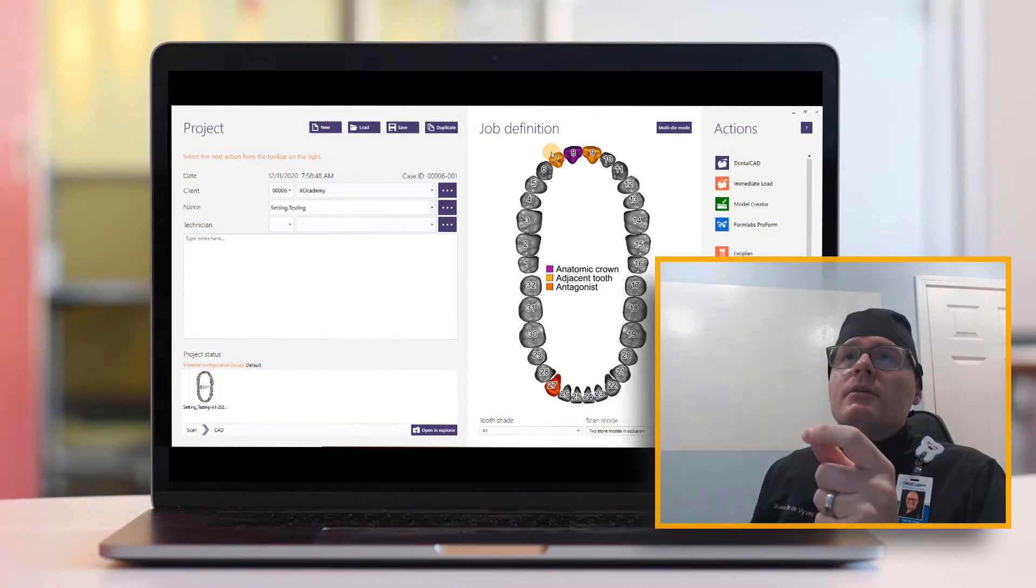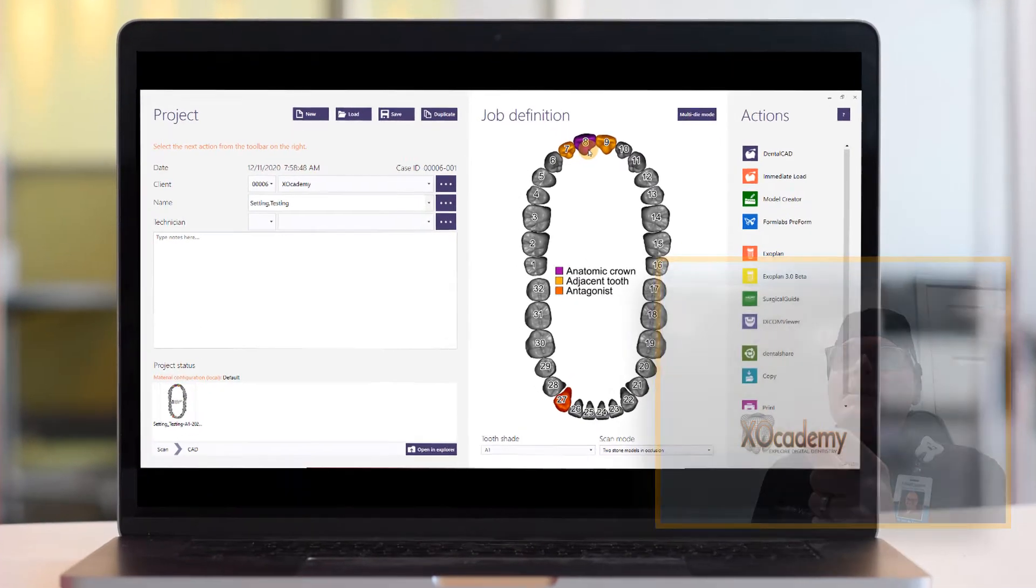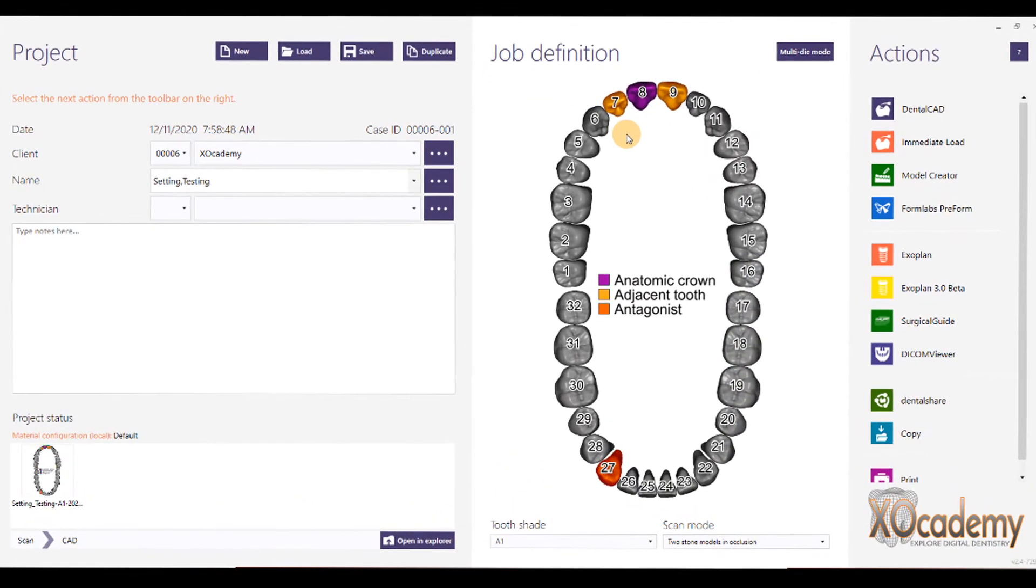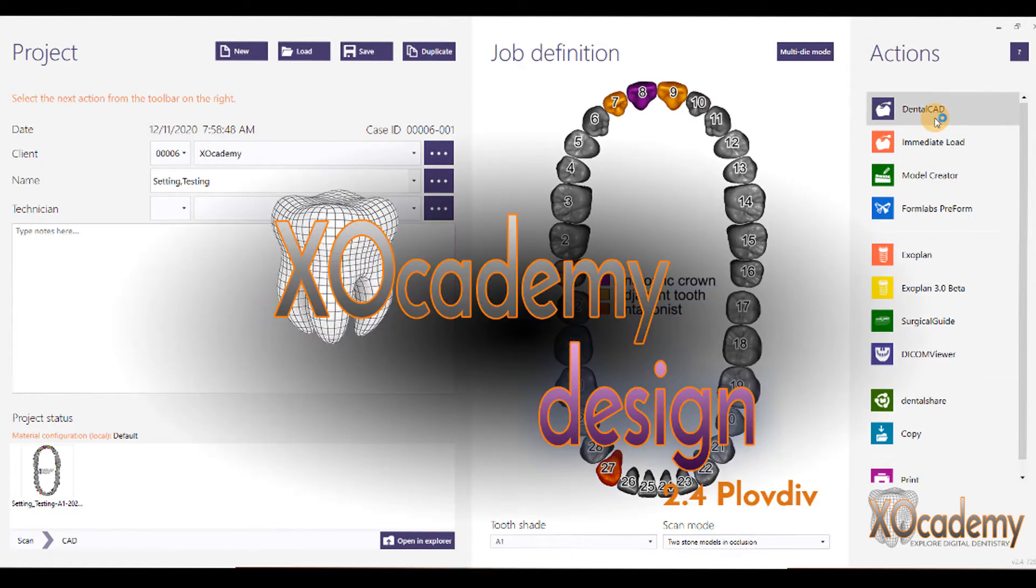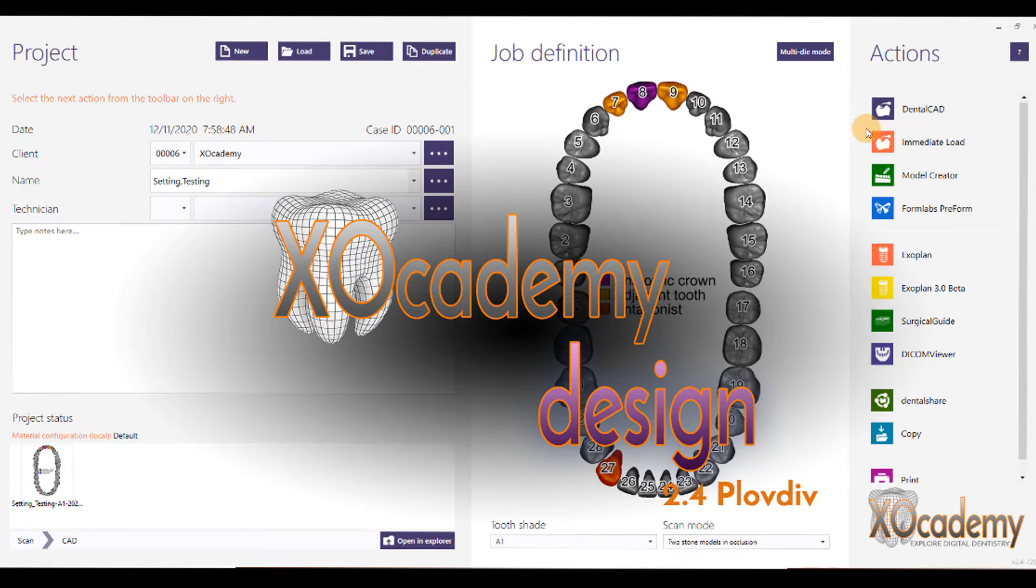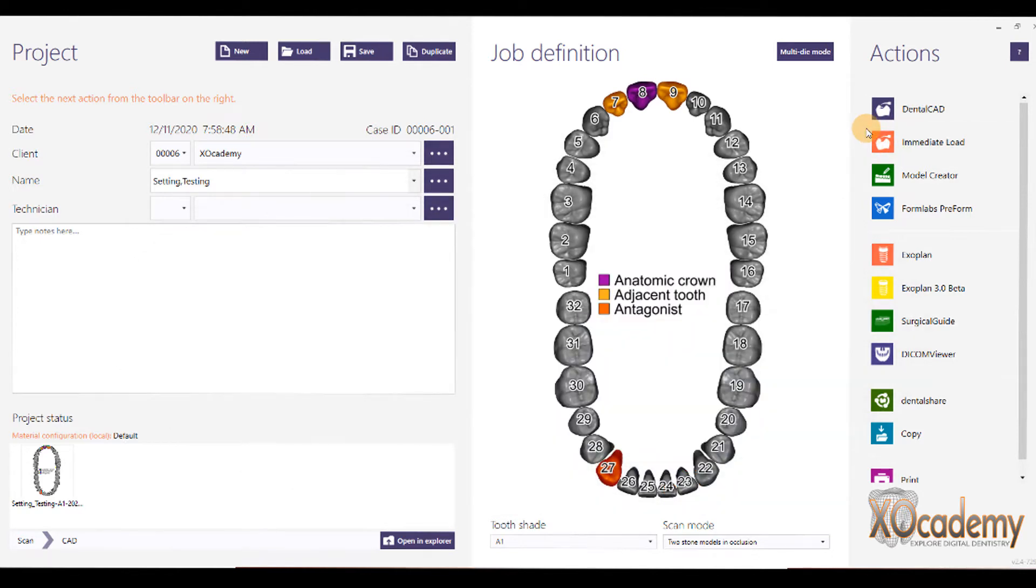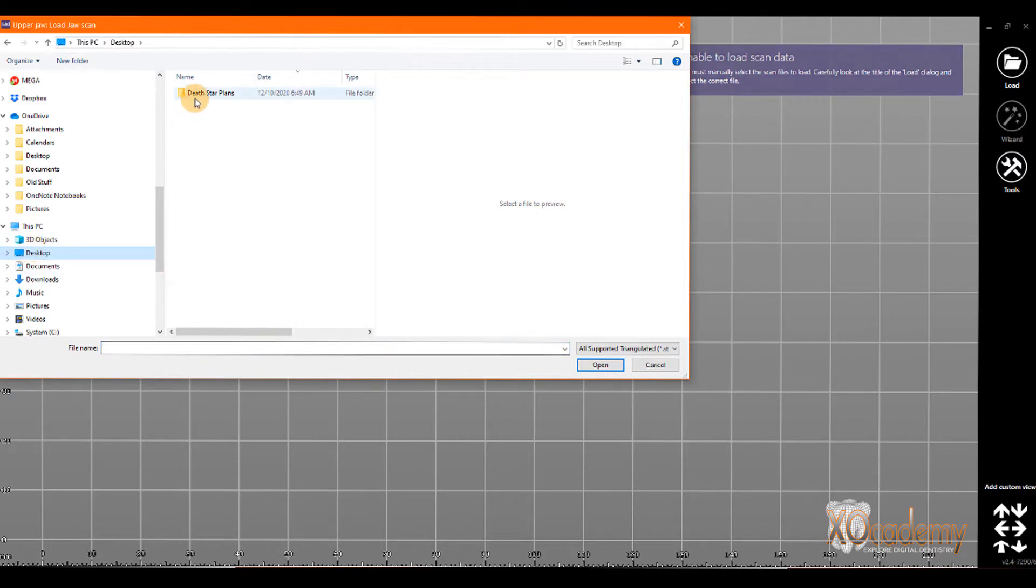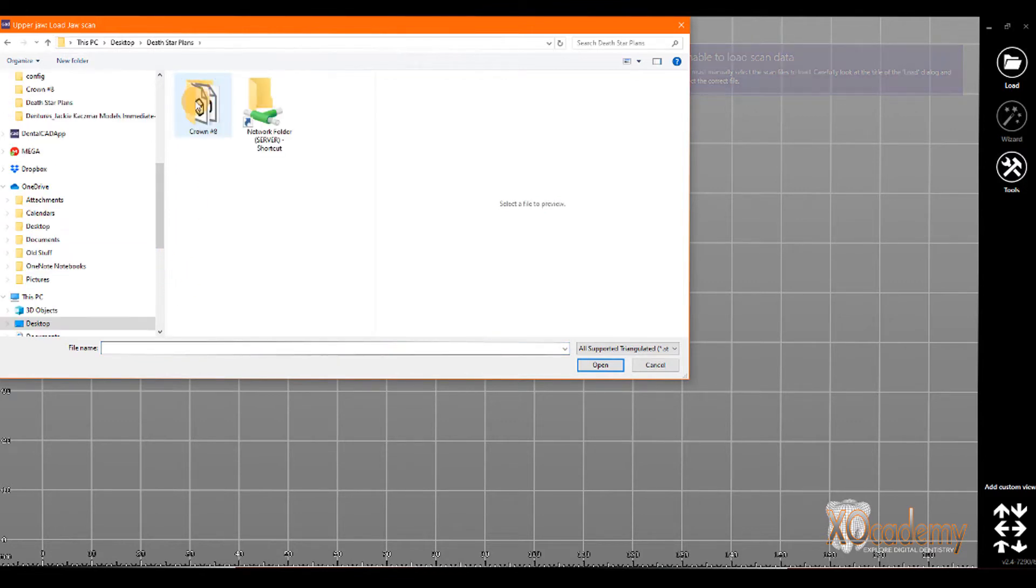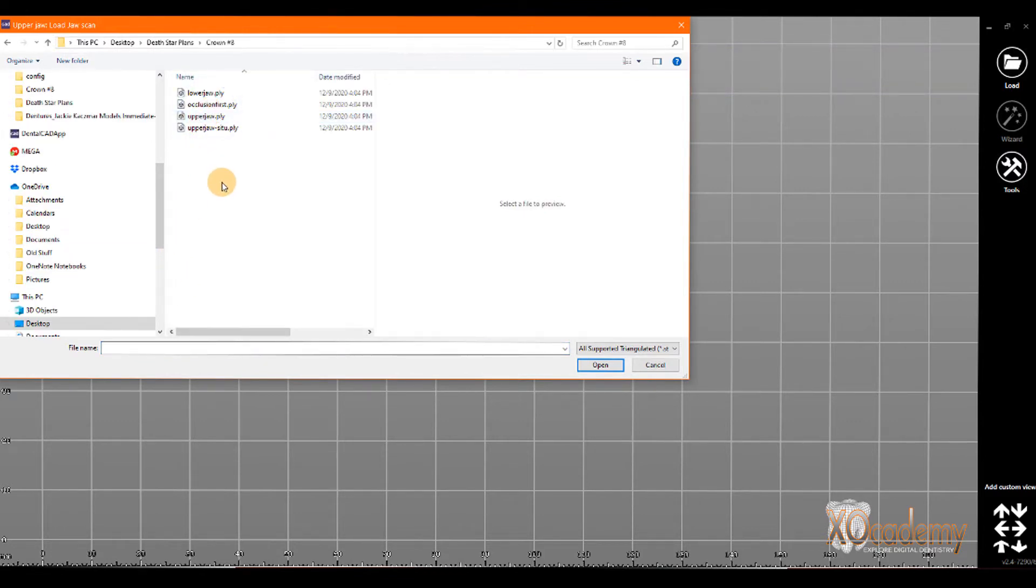Here we have the DentalDB job definition. We're going to be doing an anatomic crown on number 8 and an antagonist on the lower, and we'll start DentalCAD. I'm going to show you the issues, at least that I have, and then how to make those changes.